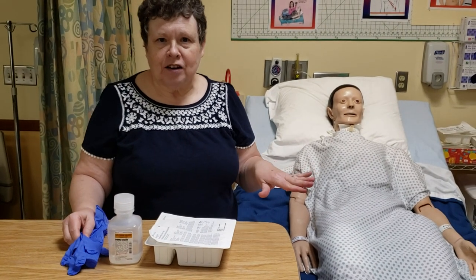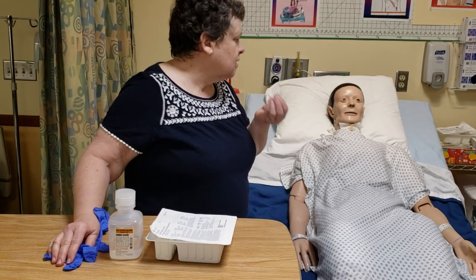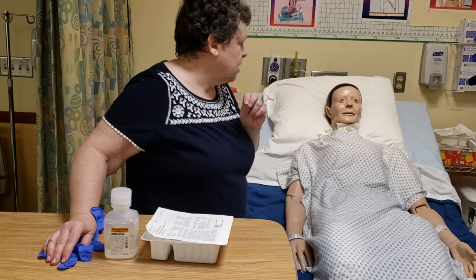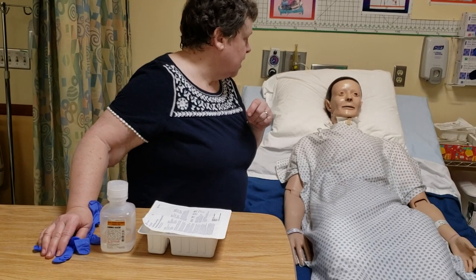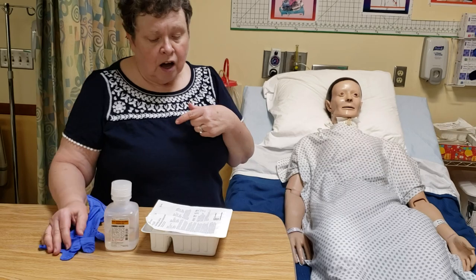We're going to do some trach care now on our patient. I am not going to be taking the inner cannula out. We're going to pretend that the inner cannula this patient has is disposable, as many of them at HMC have been. So we're basically going to be cleaning the outside of the trach.